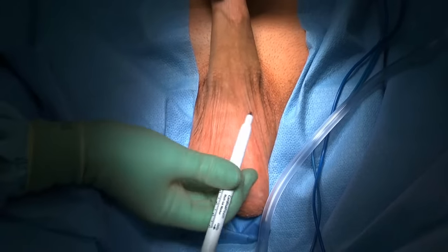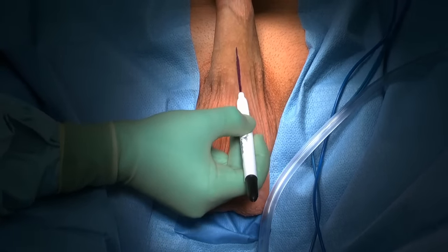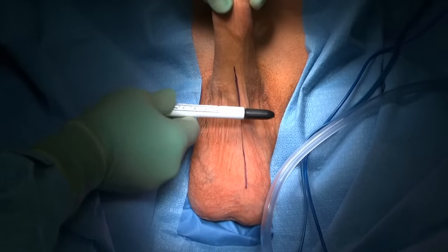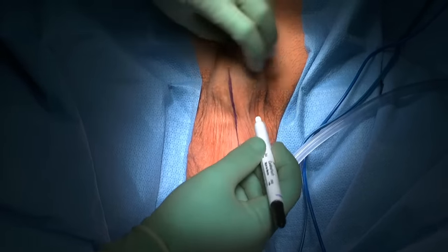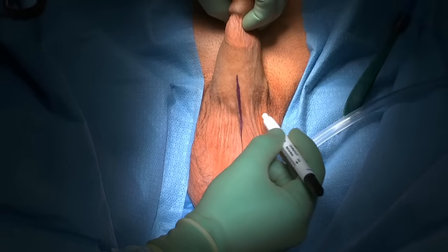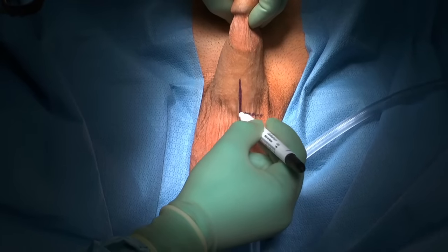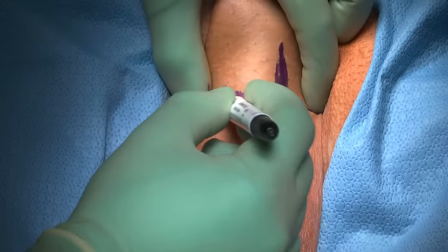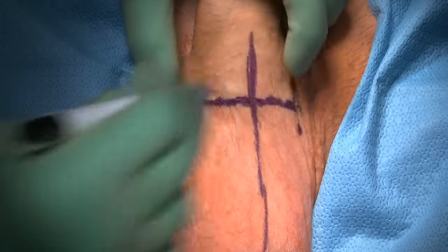Once the patient is fully draped, I like to mark the median raffae of the scrotum. Then I mark the position of a transverse scrotal incision. The OR manual indicates a vertical incision, however, I choose to make the incision horizontal as it enhances exposure in some men. We want our incision to be below the penis scrotal junction to make use of the pliability of the scrotal tissue. Generally, I like to mark this with the penis not on stretch so that I can see exactly how it's going to heal.